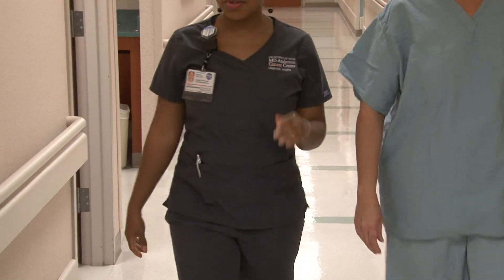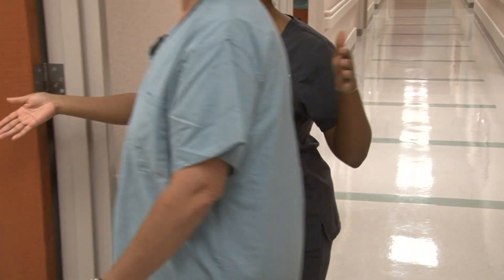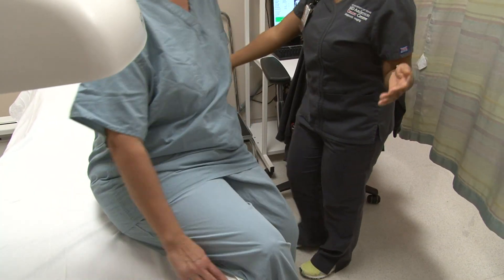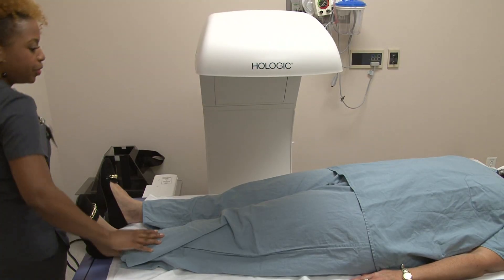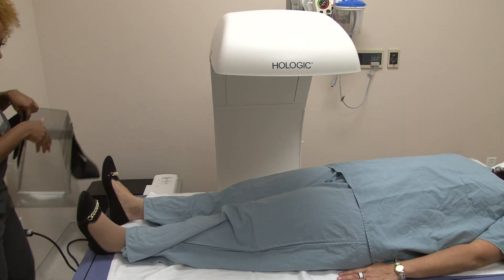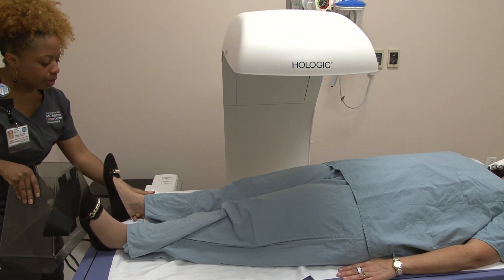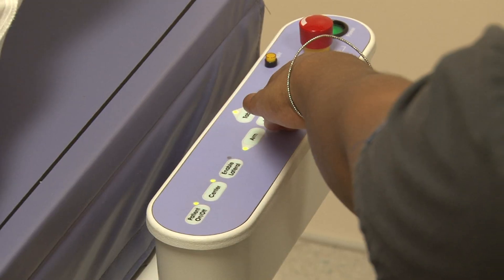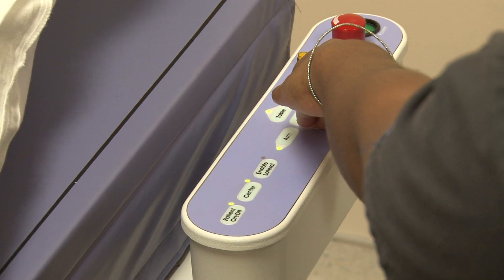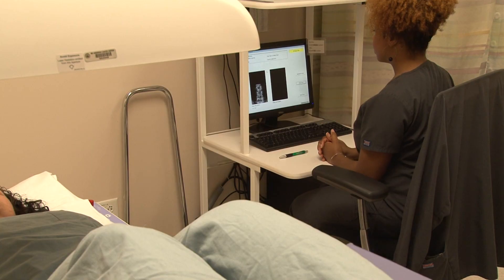During the test you will lie on a cushioned table. A mechanical arm-like device will pass over your body — this device will not touch you. The radiation dose emitted from the scanner is low, about one-tenth the dose of a chest x-ray. Do not move during the scan, as it may cause the image to be blurry.